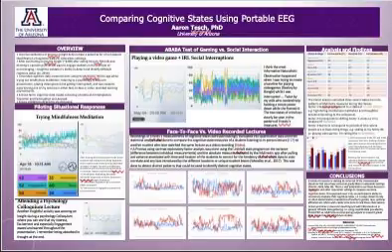And then I went back to playing my video game. When you look at the graph for this session, there are at least two different cognitive states that Emotiv was able to extract out of my EEG. While I was interacting with people in real life, you have high excitement and interest, and both of those seem to peak at those points. And then the other measures kind of dip down: the engagement and the focus and the stress and everything else.